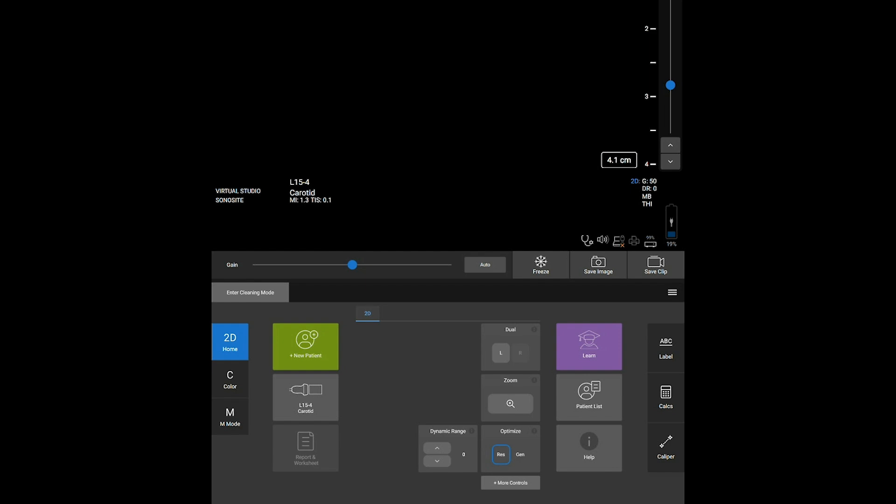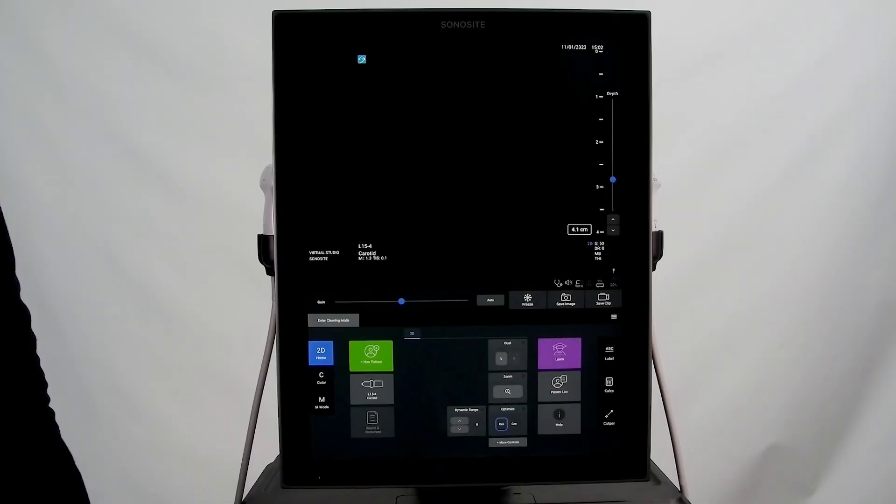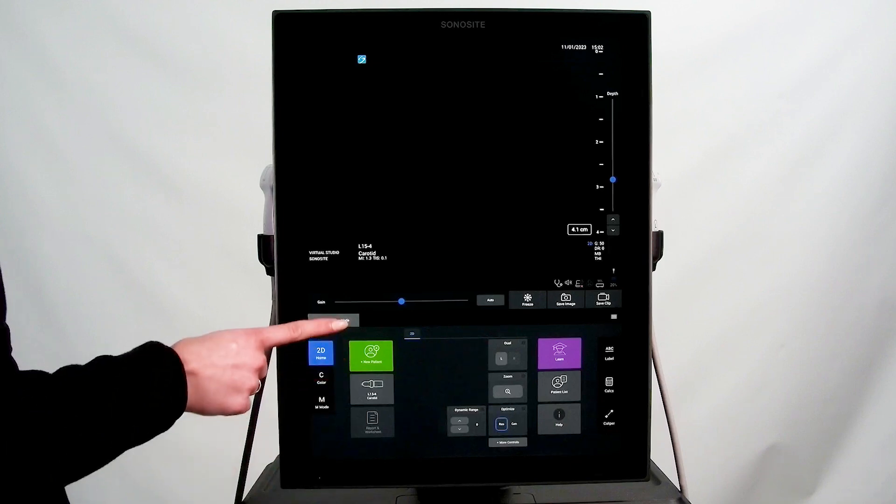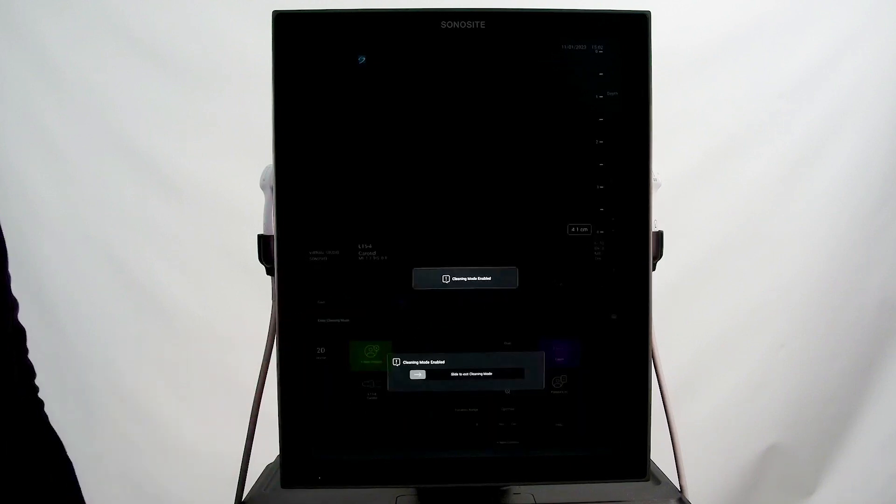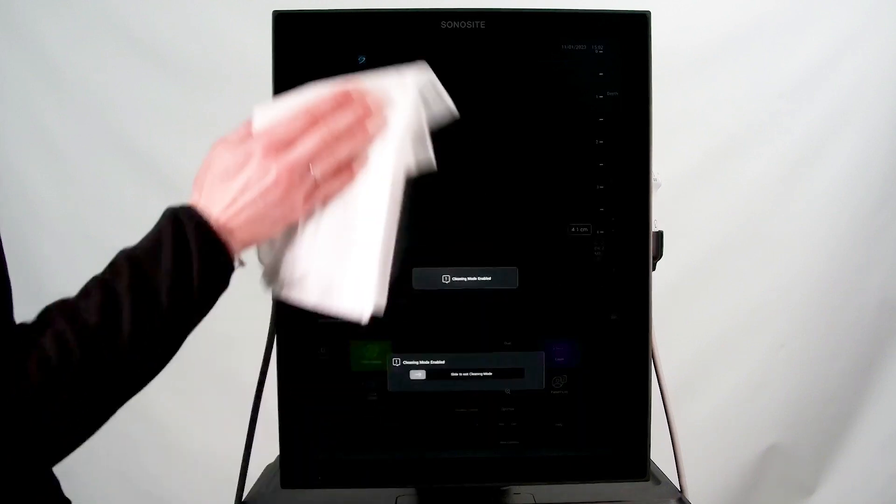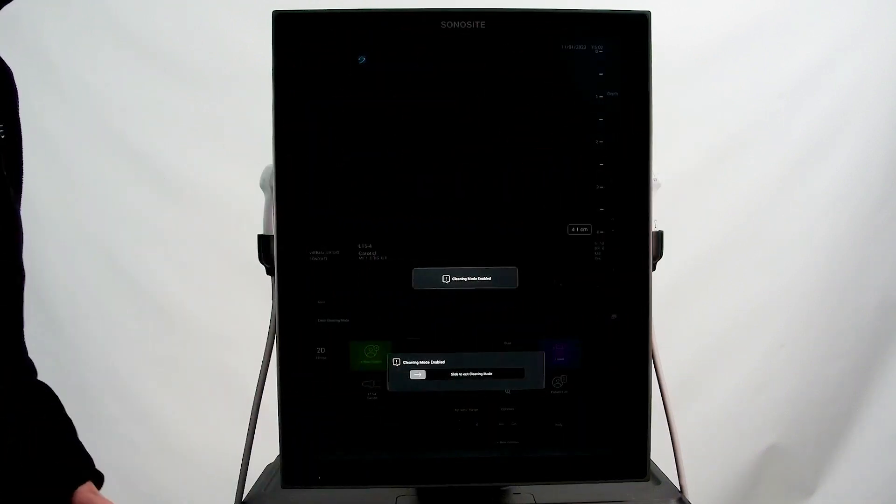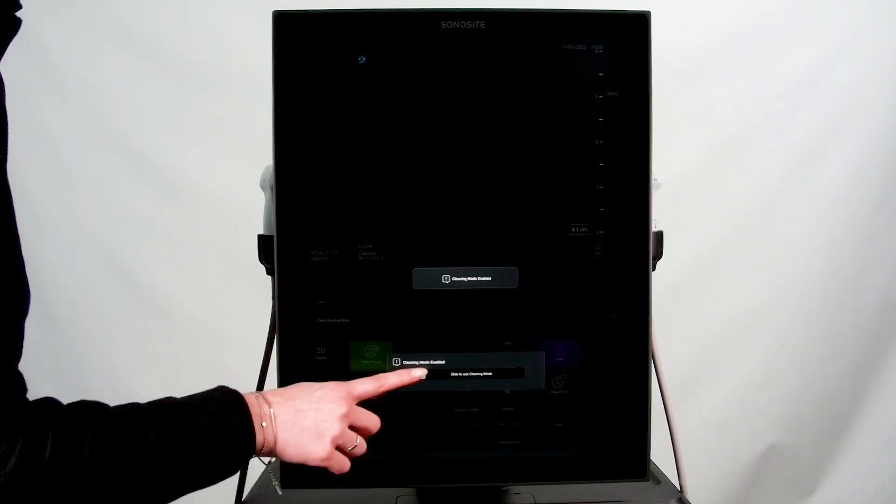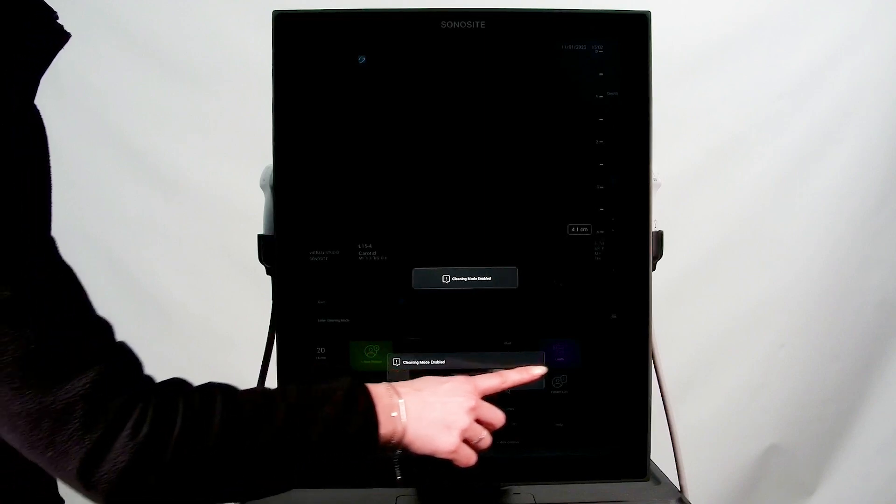System settings and other features are found under the system menu. On all the screens, you can also freeze the system controls by entering cleaning mode. Exit cleaning mode by swiping the slider on the screen.